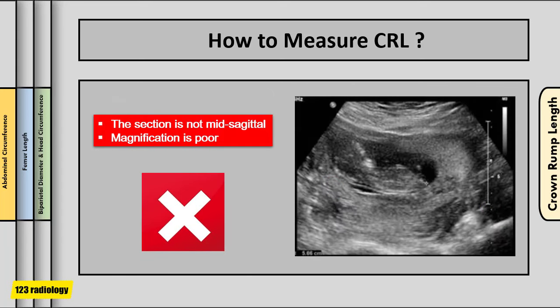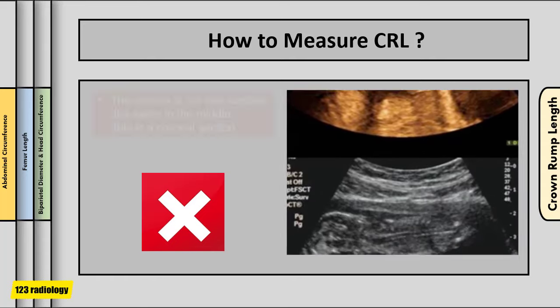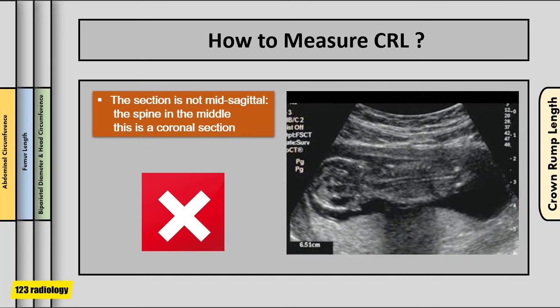Here are examples of incorrect crown rump length estimation. In the first, the section is not mid-sagittal and magnification is poor. In the second, the section is not mid-sagittal and the fetus is flexed rather than in a neutral position, leading to underestimation. In the third incorrect example, the section shows the spine in the middle — this is a coronal section; the correct crown rump length must be measured in the sagittal section, not the coronal.